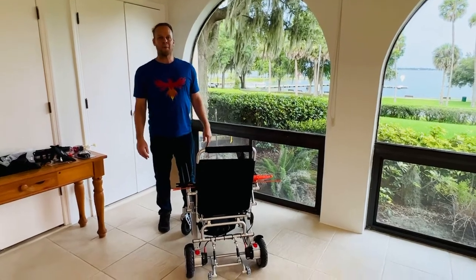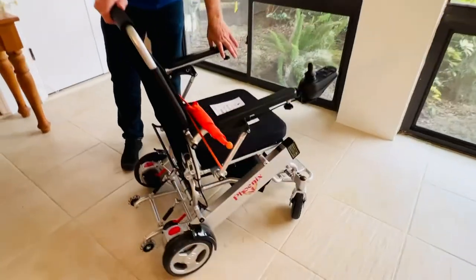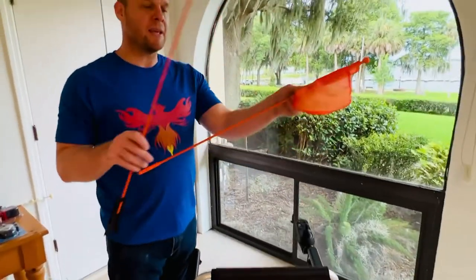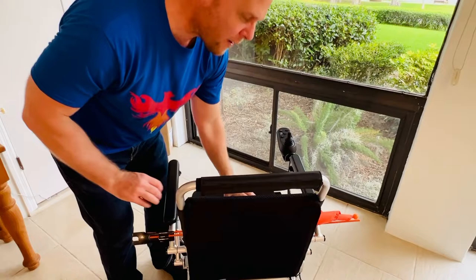Hello, this is Paul from quickandmobile.com and we are here with the Foldable Phoenix Power Wheelchair doing the video operating manual series. We have the safety flag and we're going to put the orange safety flag on the Phoenix.